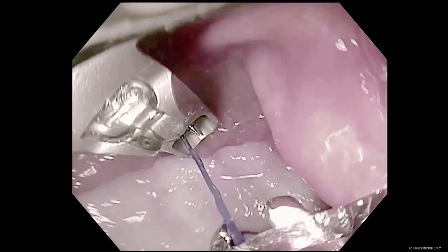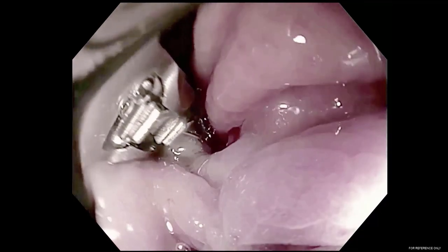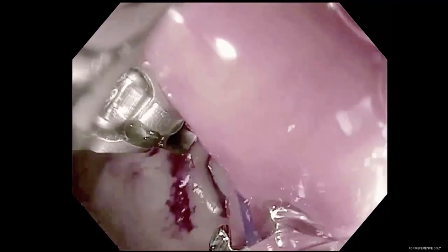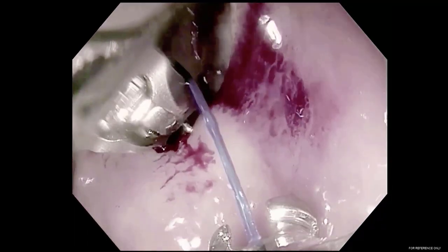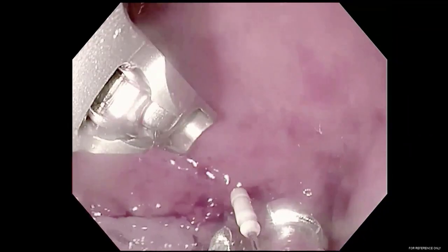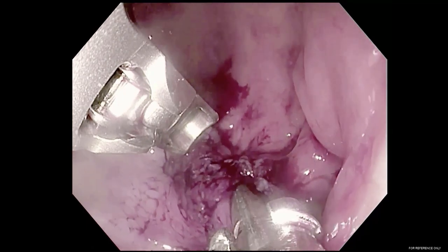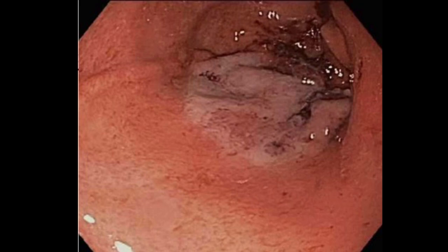We use the OverStitch device to close the gastric access. The device consists of a curved suturing arm and an anchor exchange, used to pass the needle back and forth through the tissue. We started to close the defect at the distal margin, advancing the needle from the outside to the inside margin of the defect, performing a running suture from left to right. After the last stitch, we released the needle, which served as a tissue anchor. Gentle tension was applied to oppose the margins of the defect, then the suture was secured and cut using the cinch device. This picture shows the final aspect of the closure.